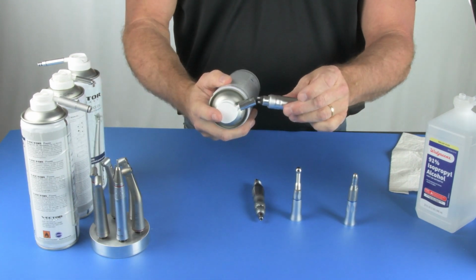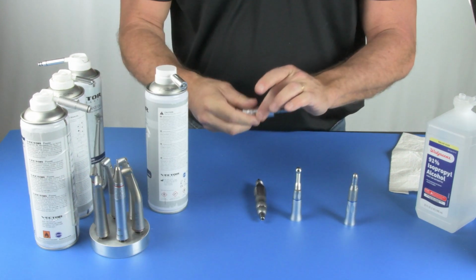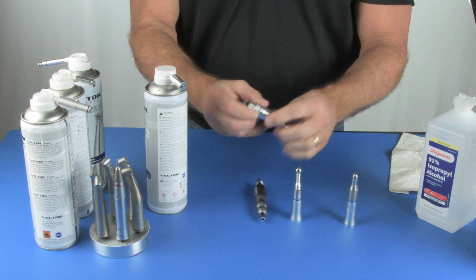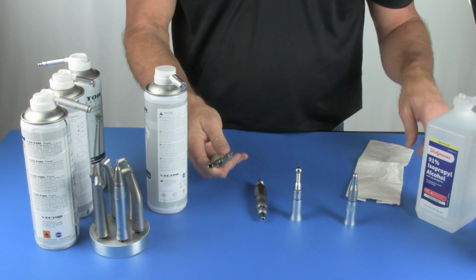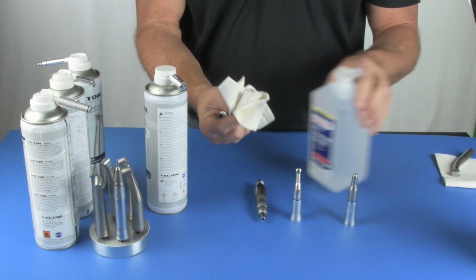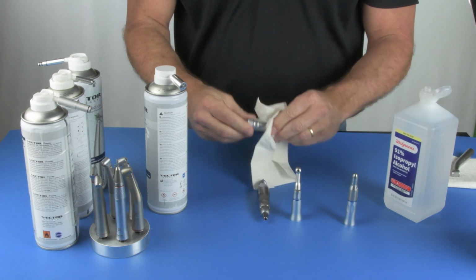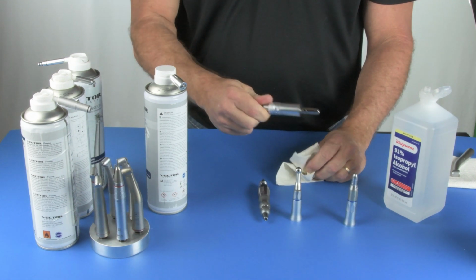So with this particular handpiece, we would go ahead and spray it for 2 seconds. Once it's done, we would run this handpiece because it is an air motor and it needs to run up and expel the excess lubricant. Once that's done, and you can take it into the operatory or use an air station to do that, bring it back, wipe off the exterior of the handpiece with a damp alcohol 2x2, only alcohol, nothing else. It will remove 99% of the oil off the handpiece. Then go ahead and autoclave the handpiece as you normally would. When it comes out, it's ready to use.